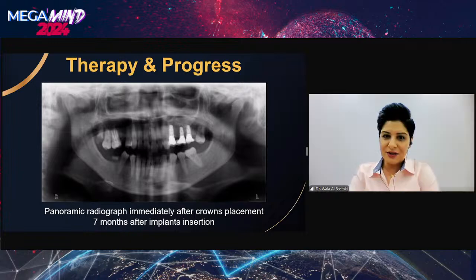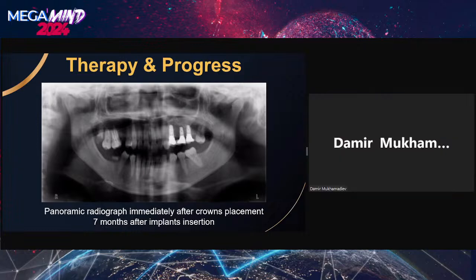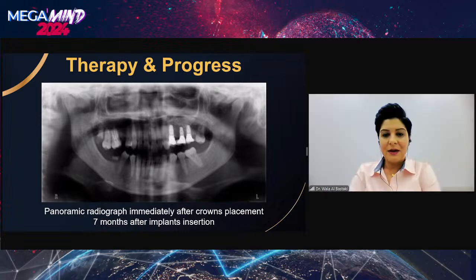Maybe I'll have to consider this in the future. Yes, if you graft a lot, you should choose the proper size of implant, because otherwise there is no sense. But in the preoperative X-ray, I couldn't even put the 11. I had some areas of 6 mm. But I will consider this in the future, definitely.